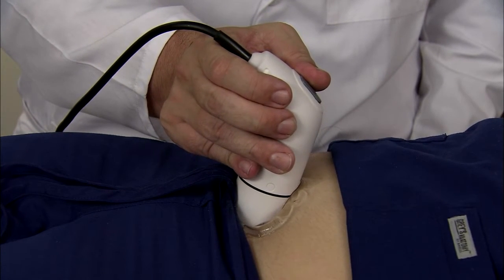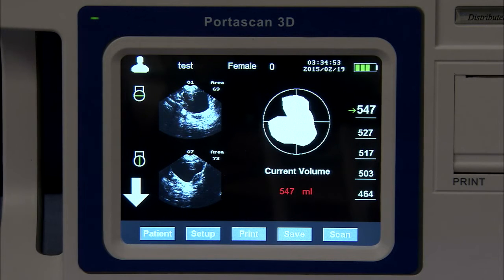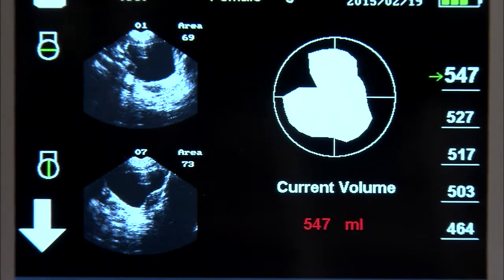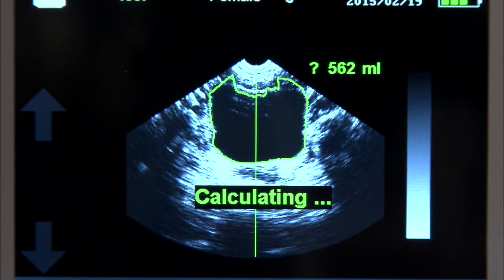As you will see, the volume at the top has a green arrow next to it. This represents the last scan performed, and also indicates this was the largest volume calculated. Had it been a lower volume, it would appear lower down in the list.